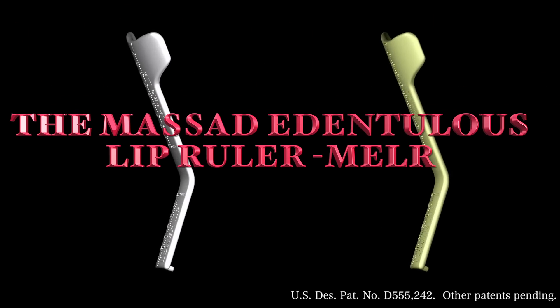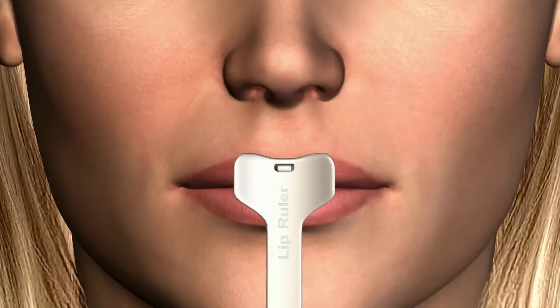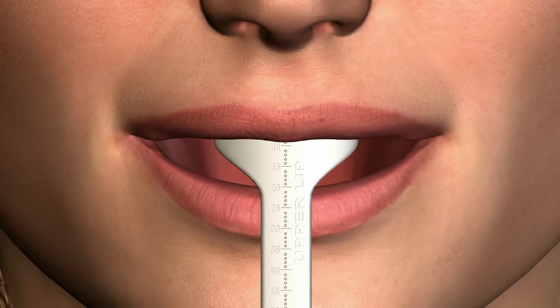The Massad Edentulous Lip Ruler, M-E-L-R, is a device that allows dentists to evaluate the aesthetic relationships of both the upper and lower lips to the oral cavity and facial mask.